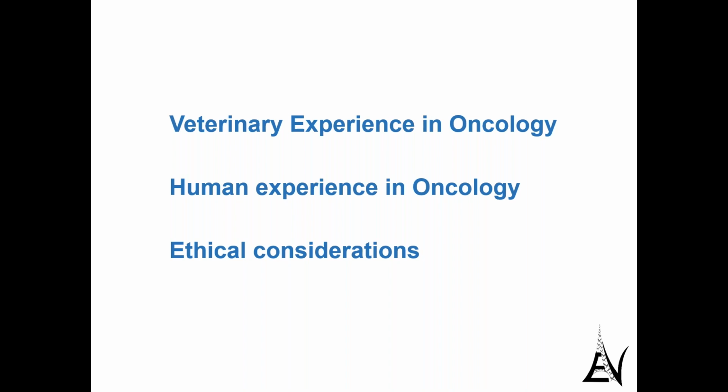And with this, Alice Villalobos, this guy in Tonon Hospital, this orthovoltage stayed in my mind. And when I decided to open a new facility back in 2013, I had to choose. And then come the ethical considerations, because this is something that I've always done in my career, trying to put myself in a situation where I don't depend on the bank. Meaning, if I had to choose a LINAC, the price of a LINAC, I do not know how to make money with this LINAC in France, in Paris, with the price of the building, the shielding.